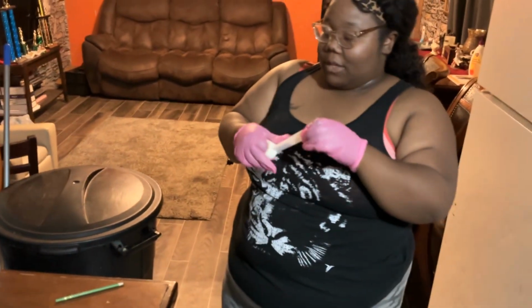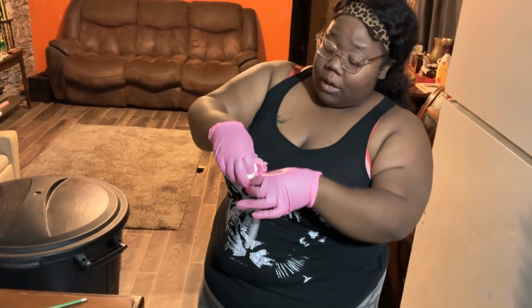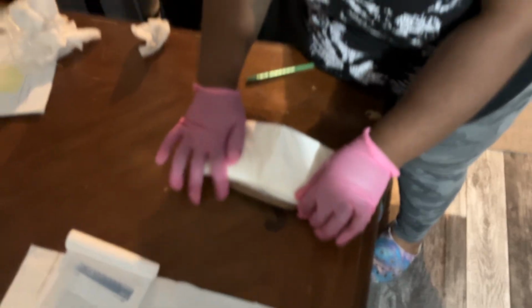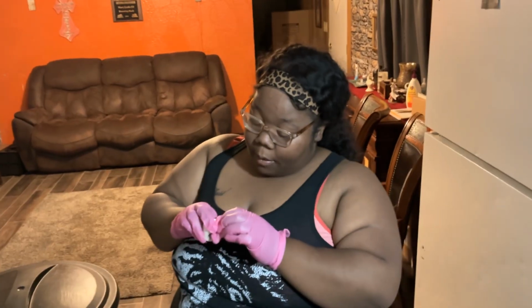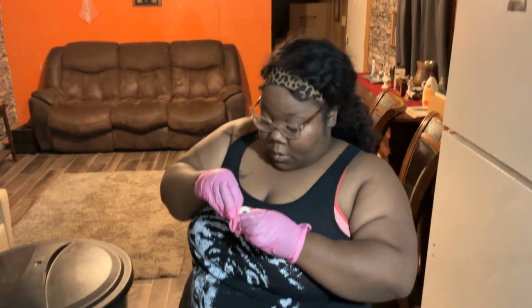Need some tape. I don't want a crazy piece of tape. And that wound is kind of hard to dress because those ABD pads and gauzes are so big and that wound is so small. But I'm going to just tape that down, enough where it will stick. I don't want a crazy big piece. I want just enough to hold my patient's dressing down.